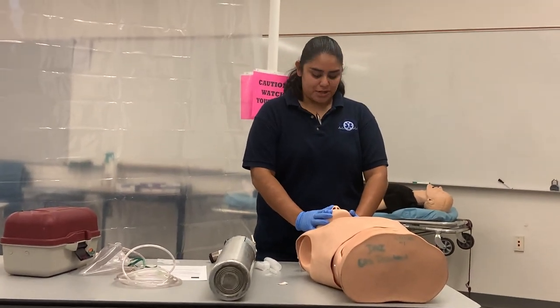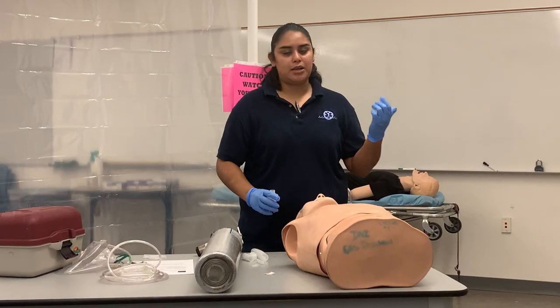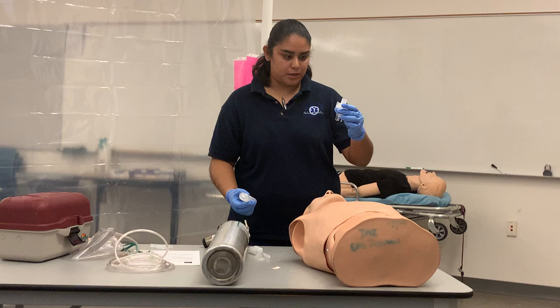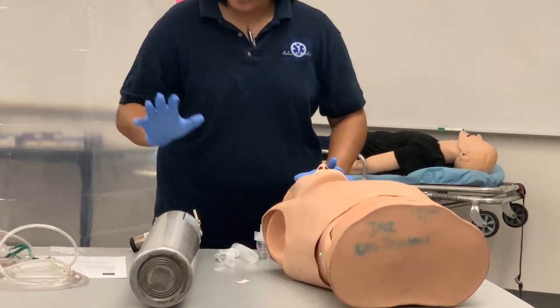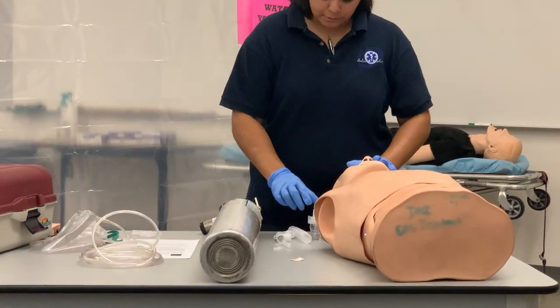This is your medication administration inhalation. First, I want to make sure I have my gloves on and my PPE. I'm going to gather my equipment, which includes the inhalation chamber and the equipment that goes with it — I've got my O2 tank and oxygen tubing.